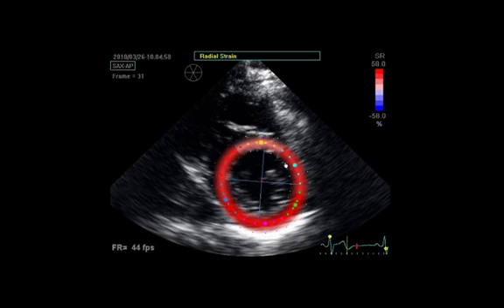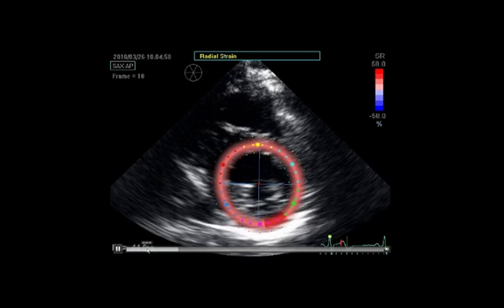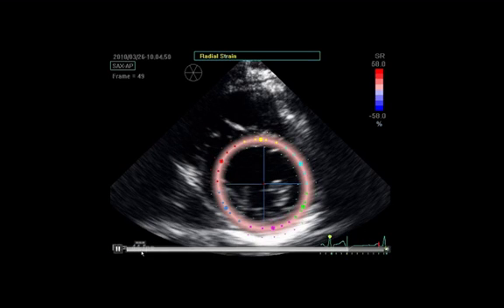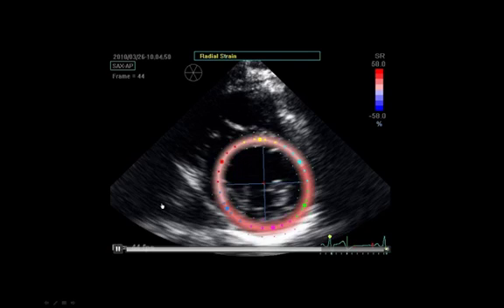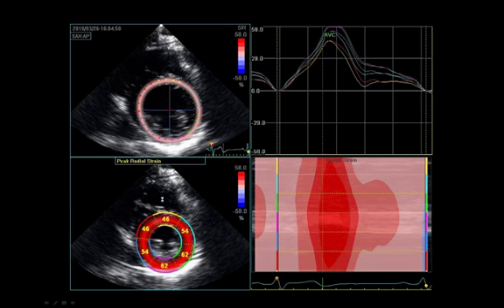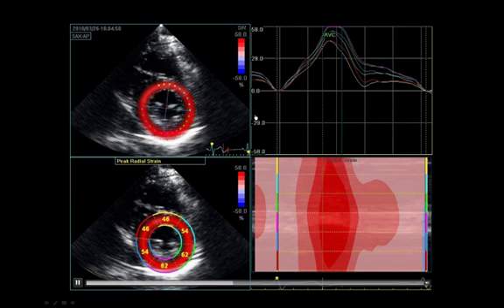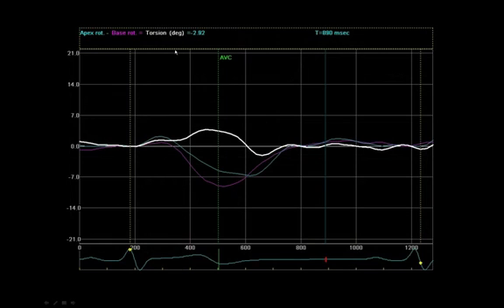Hopefully we have a frame rate higher than this one that I'm showing; we want frame rates in the 60 and above range. But when we have that, it's very easy for the system to come up with the torsion measure, in this case of 3 degrees. So the system is smart. It can do all this for you just by feeding those two images.